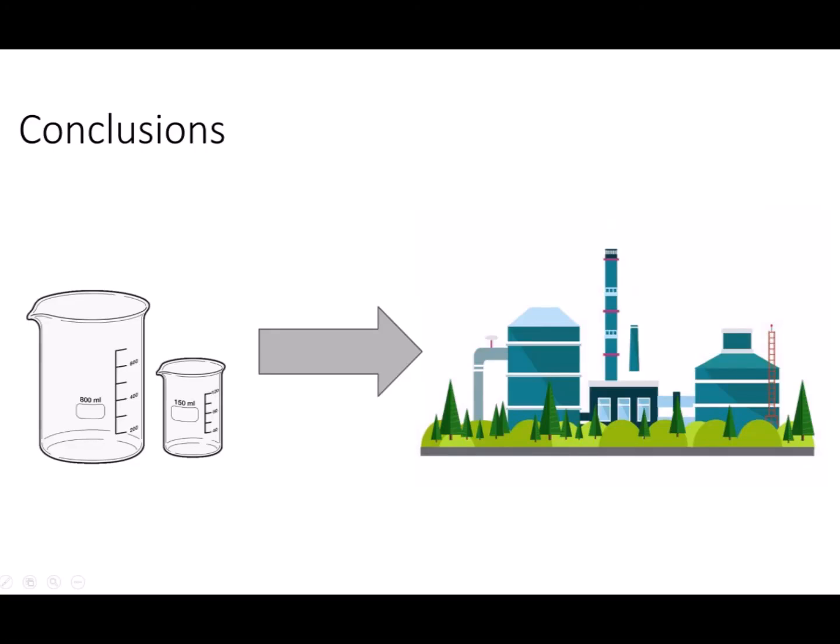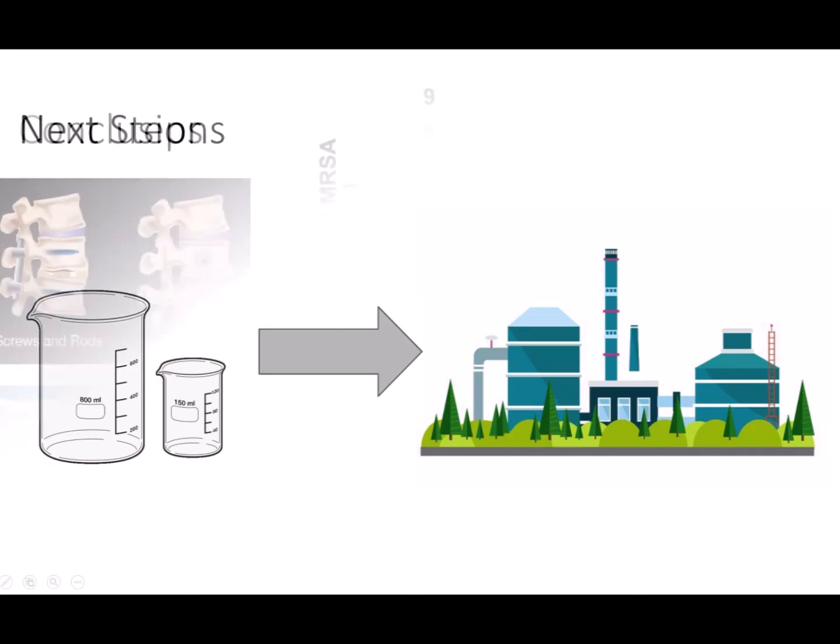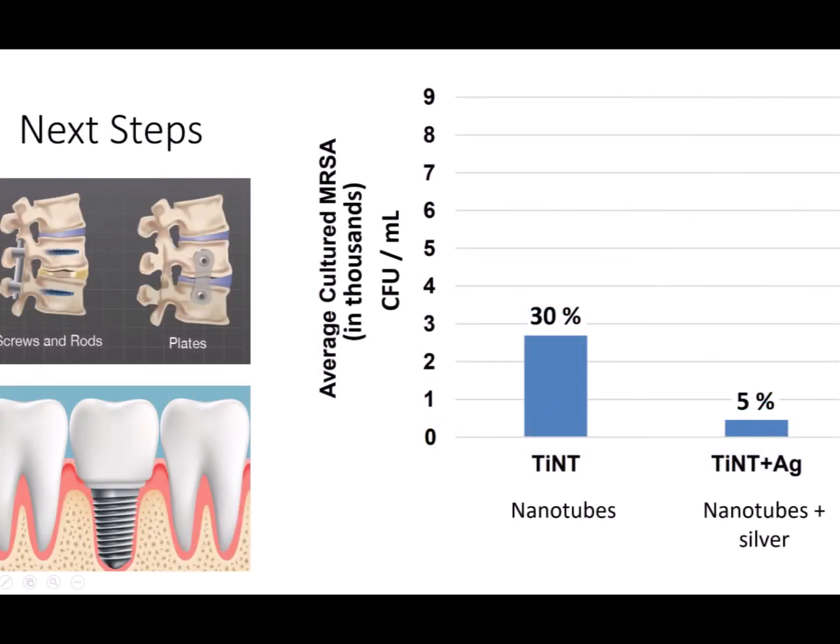We have created a resource using MATLAB for our customer contact, Dr. Friedrich, to present to the orthopedic industry with the intention of bringing the nanotexturing process from its current operation on a small scale to large-scale manufacturing. The next steps in the process include adding implant types, such as spinal or dental implants. Additionally, silver fluoride can be added to the electrolyte mixture to further increase antibacterial properties of the implants.